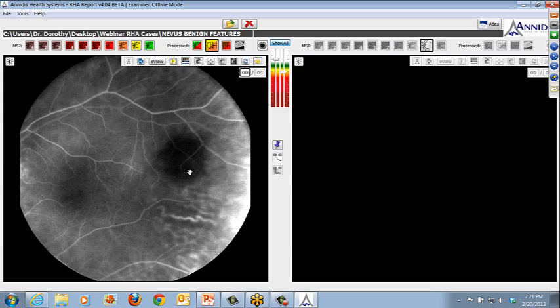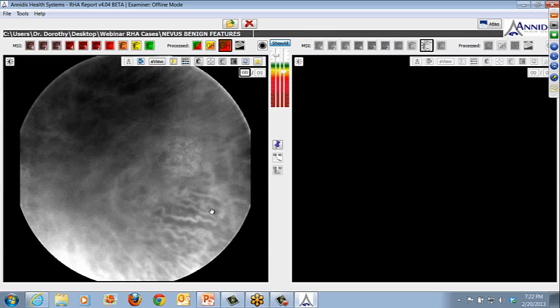On the oxy map here, if there's a break in the RPE, okay, a break in Bruch's or a general break in the RPE, that could be an indication that the lesion is elevated, has changed, has grown, and it certainly broke through the upper layers of the retina through Bruch's, and you will see some patchy areas here. Okay, this is still nice and even, and the color is even. And on the choroidal map, again, highly regular lesion. And in the choroidal map, you want to watch very carefully the edges here and to see if there are vessels that are specifically feeding that lesion and in any pattern. And I really don't see any pattern here.